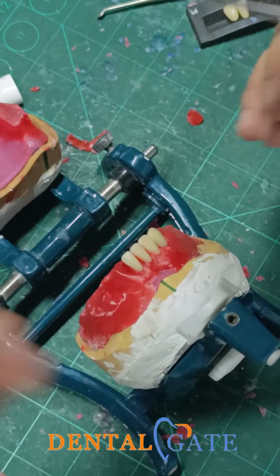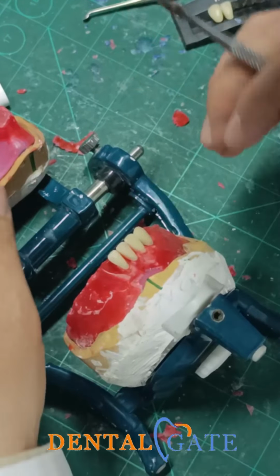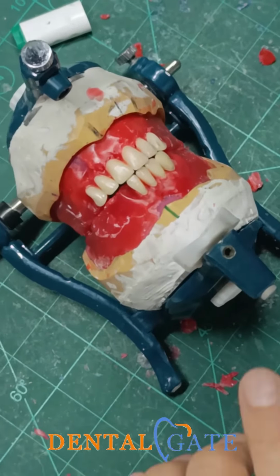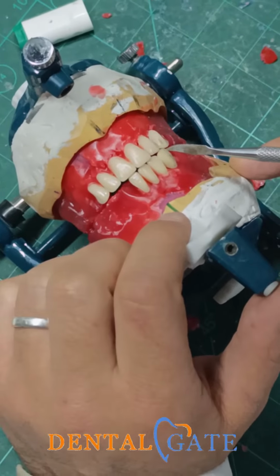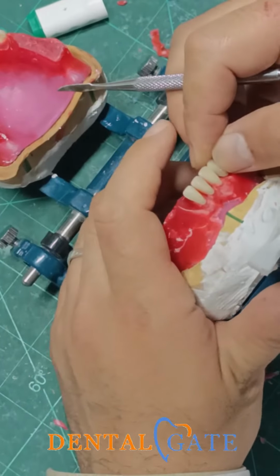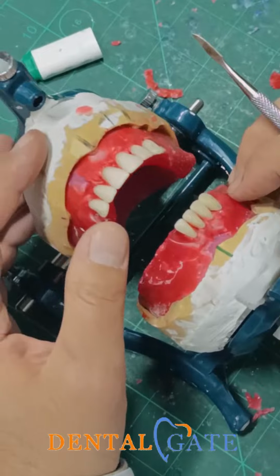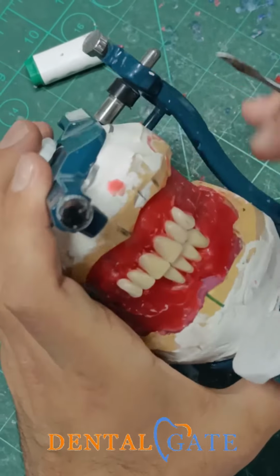If you need, make it. My recommendation is to make inclination, to avoid interference with the upper. Why? Because I need what? You can see this occlusion. What do I need for the canine? I need to make a canine relationship. The two teeth should be occluded with the one tooth. Okay? So you can make inclination, and with the scientific fundamentals, I can push it lingually to produce these criteria.